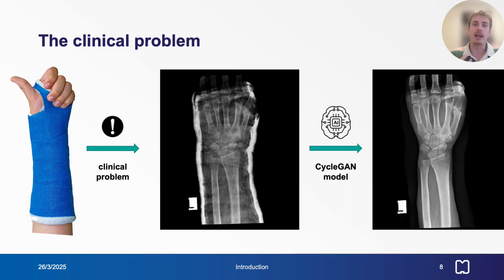So, with that example case, we furnished some motivation for the clinical problem, which is that damaged limbs often require stabilization using splints and casts made of resin, fiberglass, or plaster. Removing the cast before imaging is impractical during follow-up radiographs that monitor the position or healing of fractures.